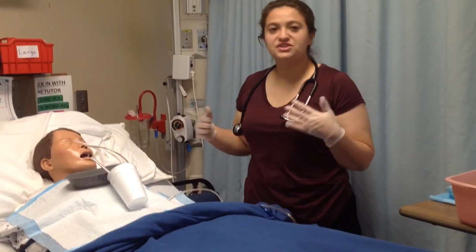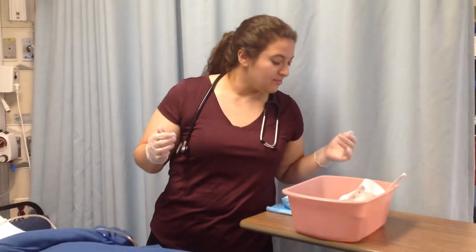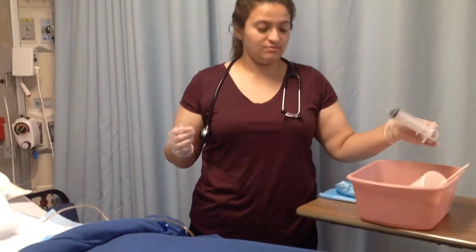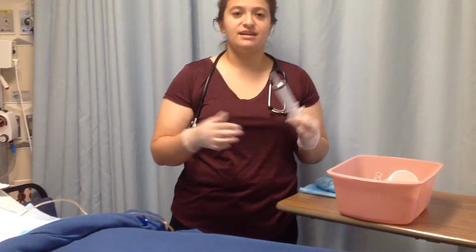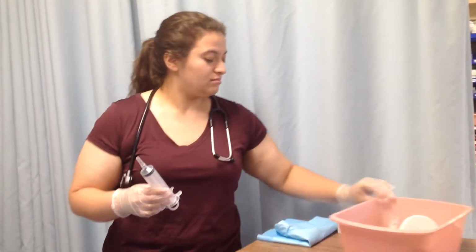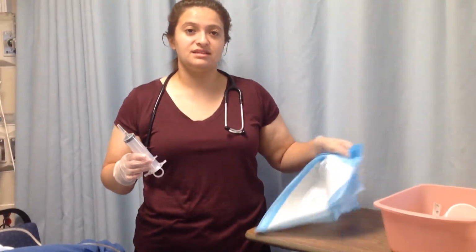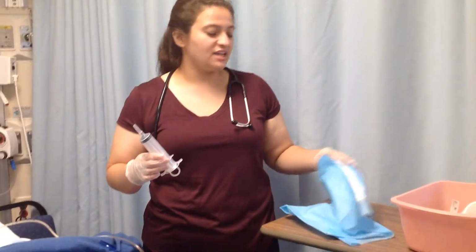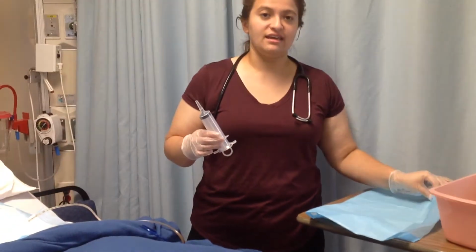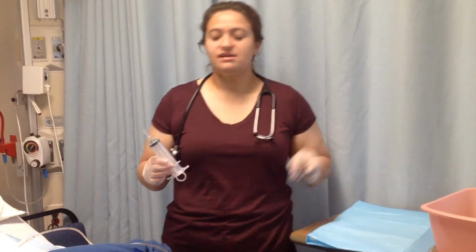Then I would make sure that the patient is comfortable and that they're okay, and then I would take my syringe. I would make sure that obviously it is in a package because we do want it to be clean. And I would also have set out at least some paper towels, so once I take the contents to look at the pH, I don't want to get the patient's room dirty with any stomach contents. So I'm just going to have this here.